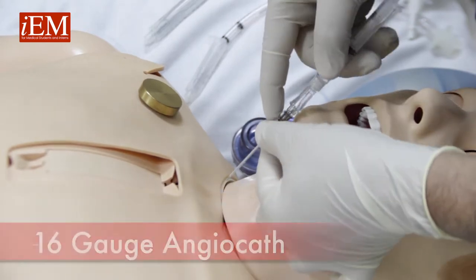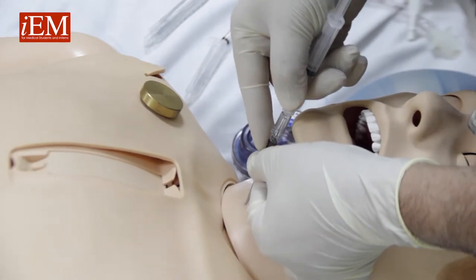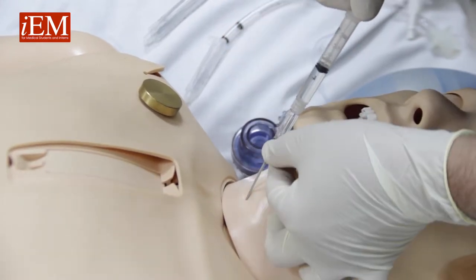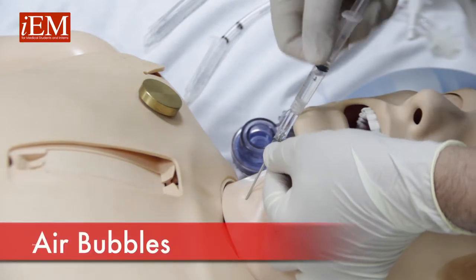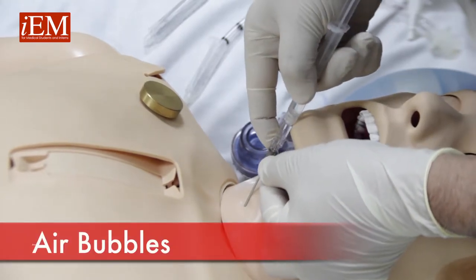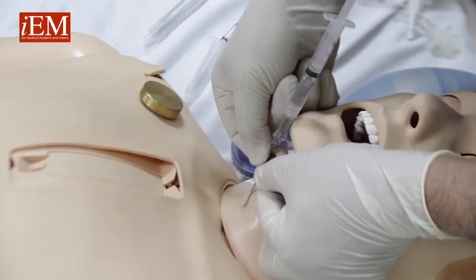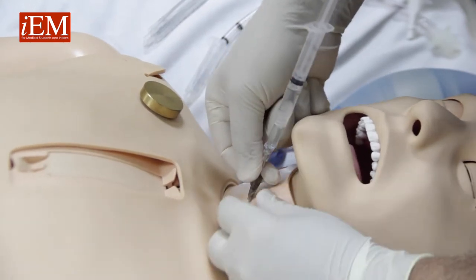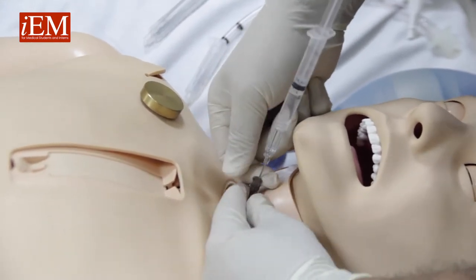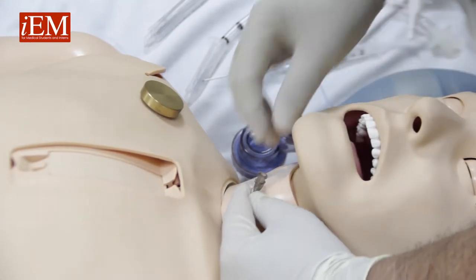Take your 16-gauge catheter, put it in — it is connected — and you aspirate. When you get the bubble, you know you're into the trachea. Then you advance, pull the needle out, and advance your catheter in. Now we're inside the airway.